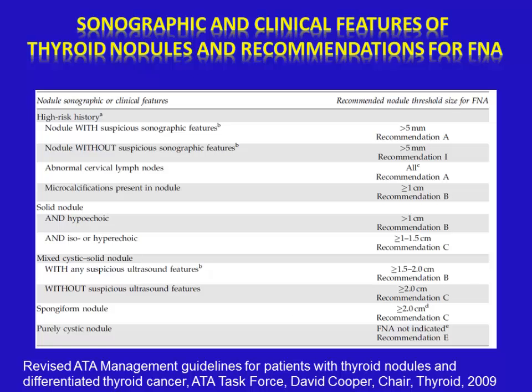This table was introduced by the American Thyroid Association in 2009 and shows a correlation between the ultrasound features of the nodule as well as the clinical features, in the form of the risk of this nodule to be malignant based on the history of the patient, as well as at which level we should go for fine needle aspiration biopsy.